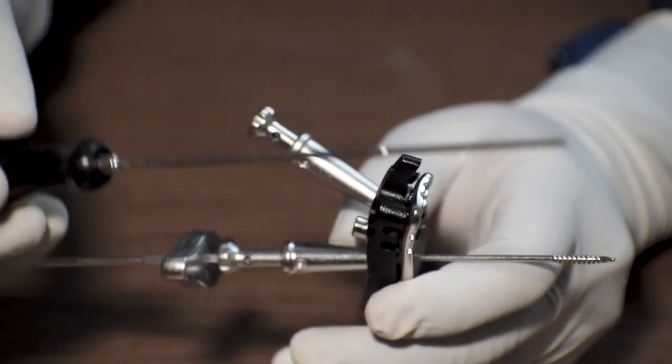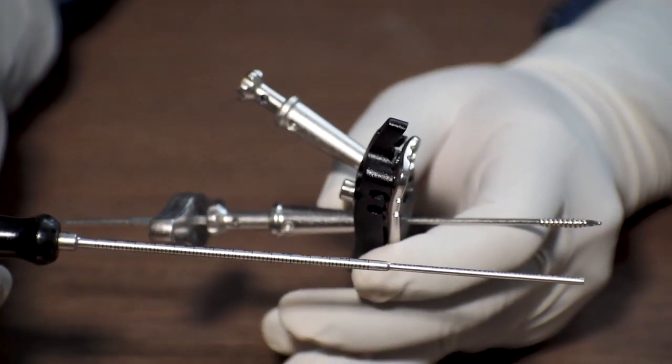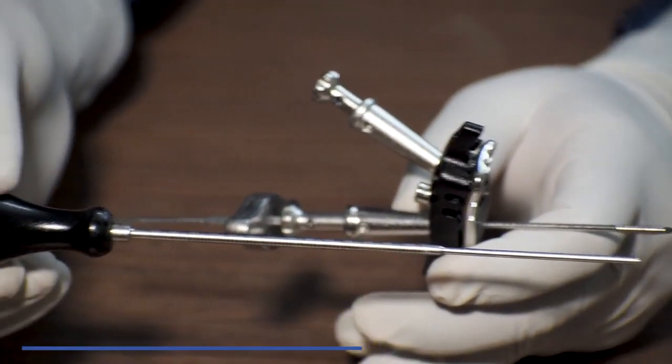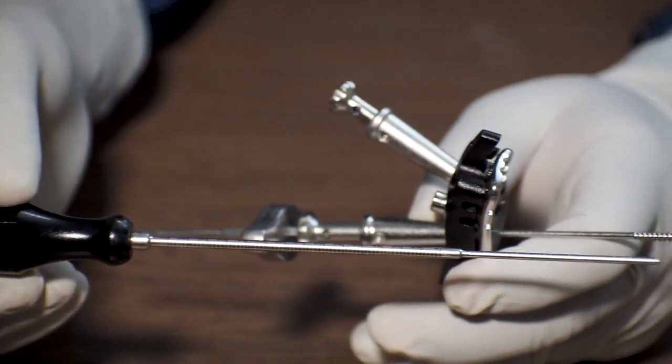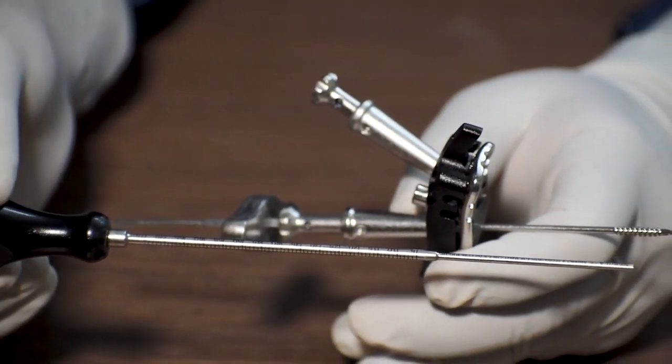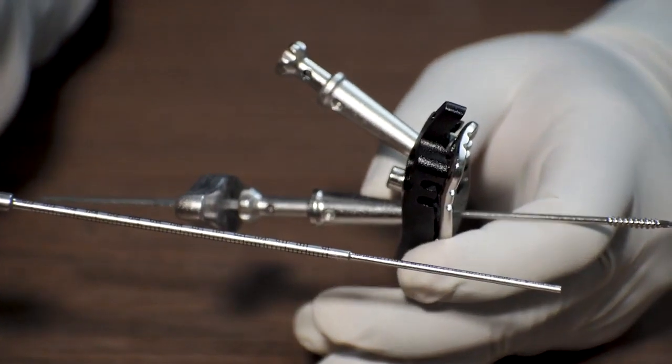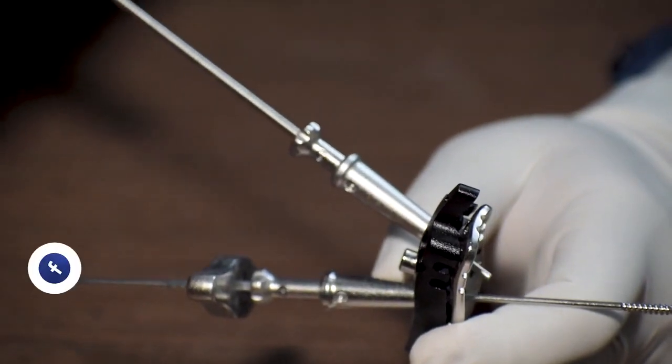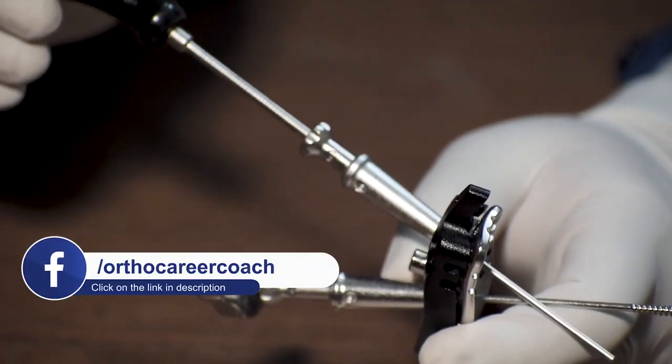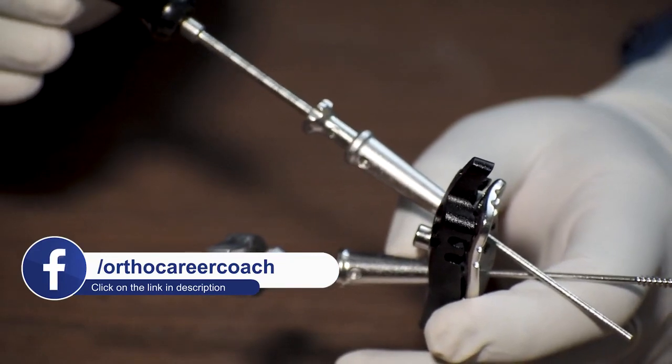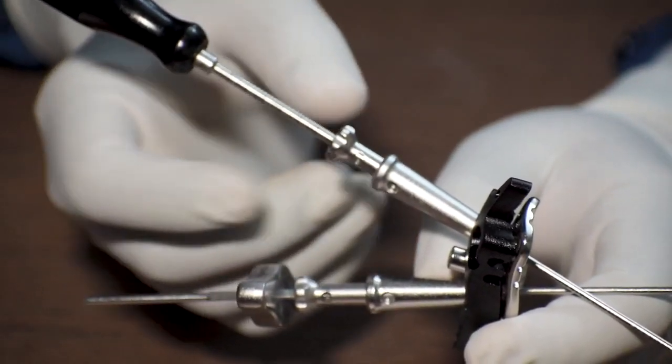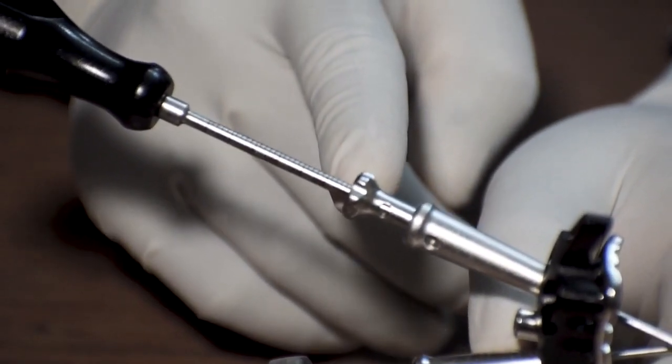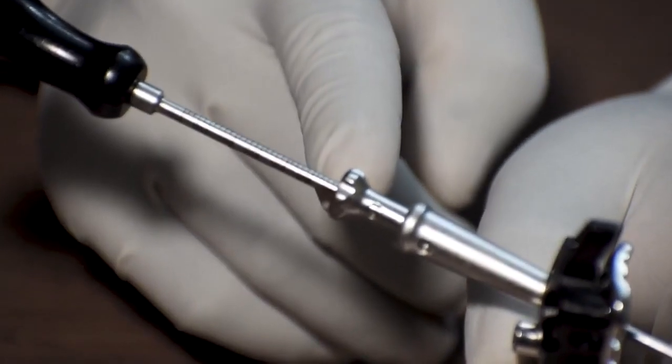There is another instrument that you can use which is called a Phyllos LCP Length Probe. This is used to measure the length of the screw that is needed to be fixed. We will insert the length probe through the drill sleeve till the point the drilling is done, and then we will record the measurement that comes, which in this case we consider as 45 mm. As you can see there are markings on the surface for you to record the length.